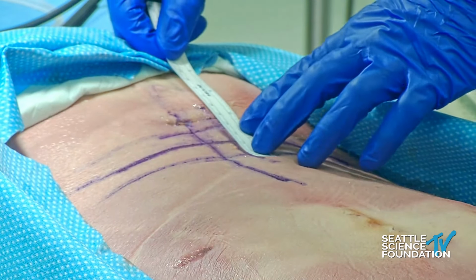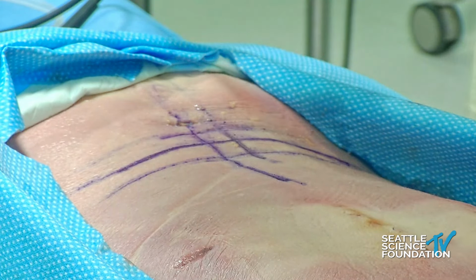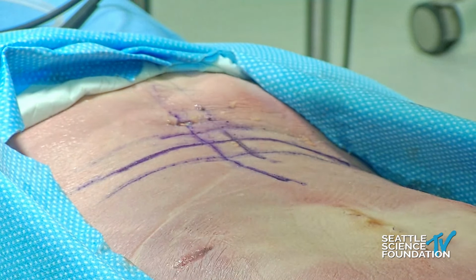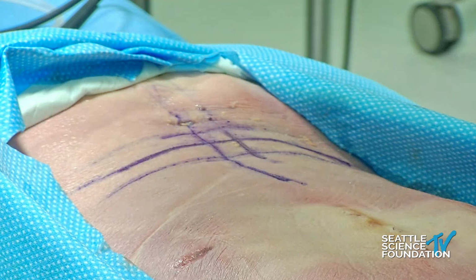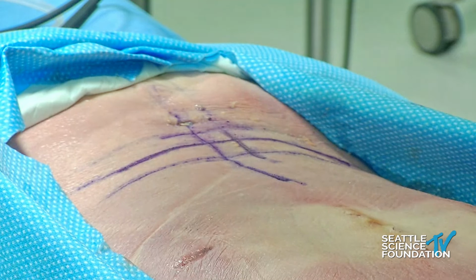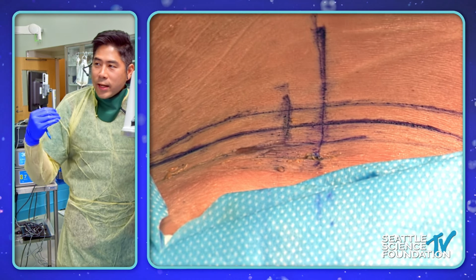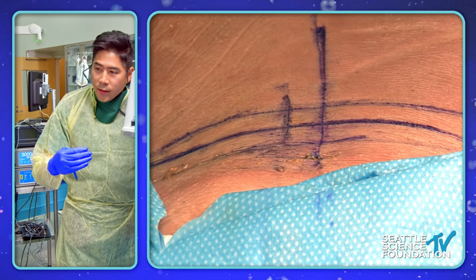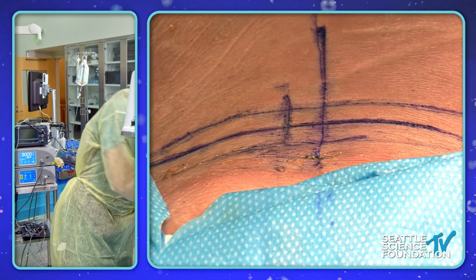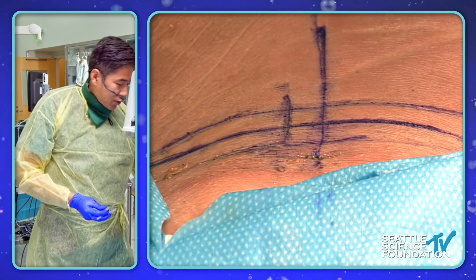So you want to keep these two incisions close. Right now I'm measuring in this patient about 3.5 centimeters, which is fine. If I'm doing a decompression here, I may want to enter around the more medial part of the pedicle in terms of lateral medial. If I'm doing a fusion, I want to enter at the mid-pedicle. If I'm doing an extraforaminal, transforaminal approach, then I'll go outside the pedicle for my entry point. So these markers give you a general idea where to start.